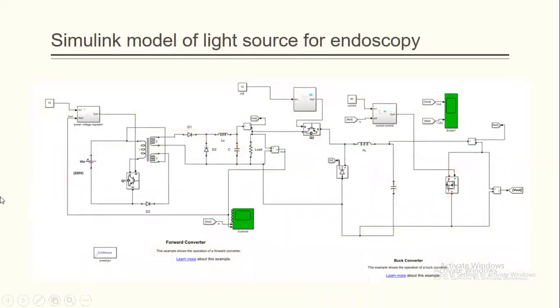Simulink model right here. It's combining both the forward converter and the buck converter. So, right here we have a 100 watt output from the forward converter into the buck converter. It's 8.3 amperes and 12 volt output feeding the buck converter.